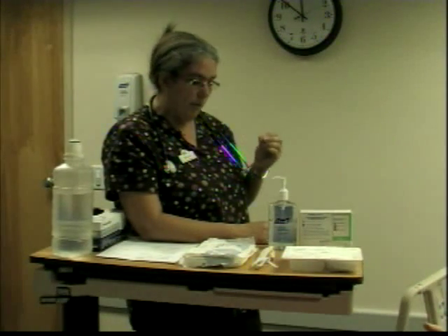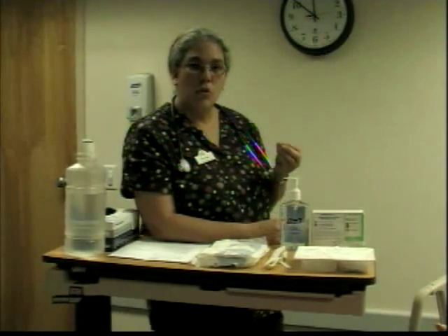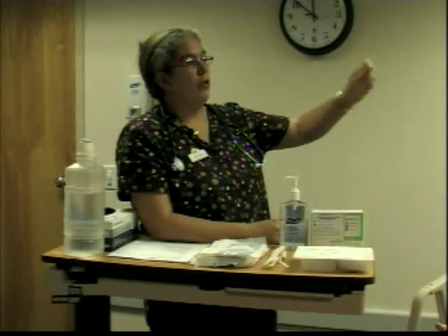That's another thing that you want to make sure of: you know the size of your client's tracheostomy, and you have an extra tracheostomy kit at the bedside in the patient's size. And you'll see the size right here, 7.0. Also, equipment-wise, you want to make sure that you have suction, and then check that it's on the right level, anywhere from 80 to 100, 120. And you want to actually check it to make sure that it works, that there's suction on the wall, and that the client has working oxygen.